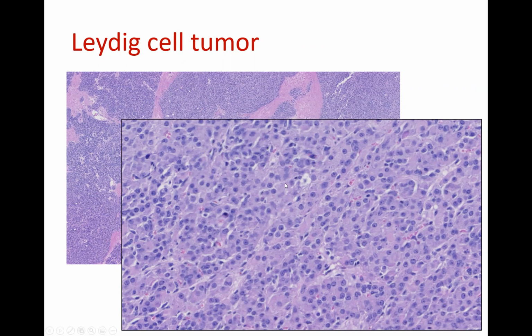They are all monotonous. Look at the prominent nucleoli, a lot of RNA in these nuclei, because these cells are forming steroids, they are very hormonally active. They are androgenic. You don't see mitosis. So what is your diagnosis here? My diagnosis should be Leydig cell tumor. Of course, I'm helped if the clinician tells me that the patient has hirsutism.